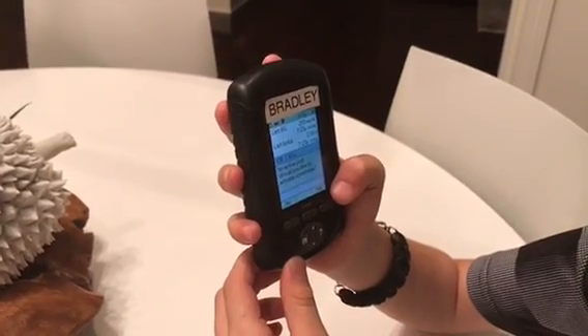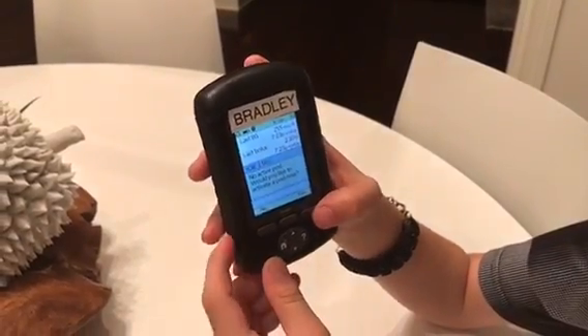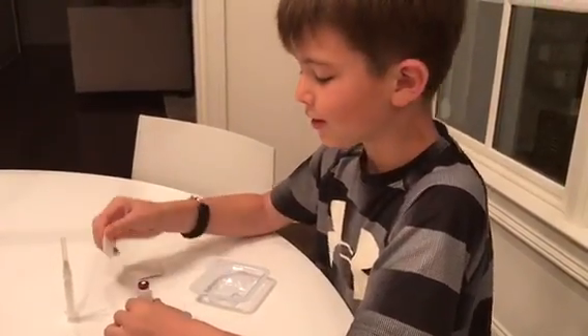Omnipod is asking me if I want to activate a new pod now. You should hit yes. Now I will wipe the top of my insulin bottle to clean it.